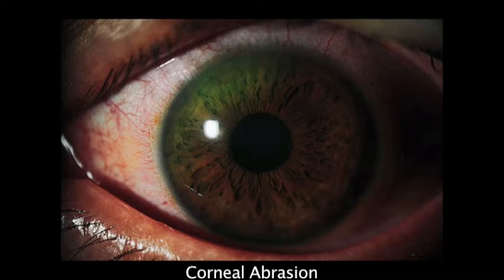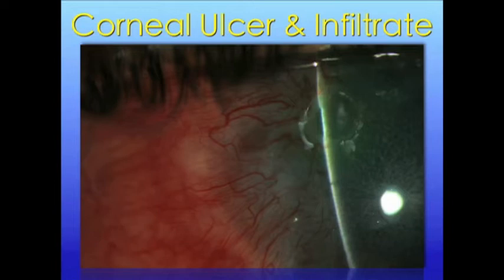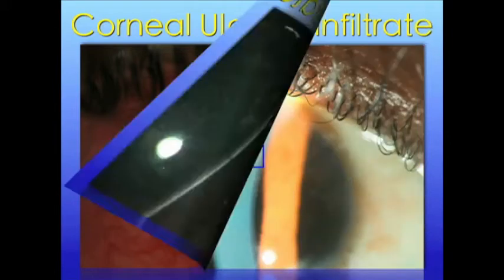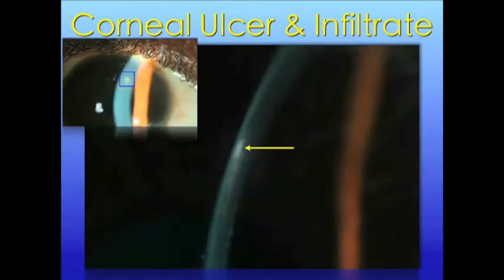Be sure to evert the upper eyelid to exclude the presence of a foreign body. Corneal abrasions are painful. Apply anesthetic to the surface of the cornea before applying the fluorescein dye. Complete relief of symptoms with topical anesthetic supports the diagnosis. This is a corneal ulcer. Fluorescein will stain any associated epithelial defect. A whitish outer ring, or focal white spot, known as an infiltrate, represents reactive white blood cells. Using the slit beam, you can estimate the depth of ulceration or thinning of the cornea. Notice how the slit beam is thinner between the two arrows. You can also estimate the depth of infiltration with the slit beam. This infiltrate involves only the superficial layers of the cornea.